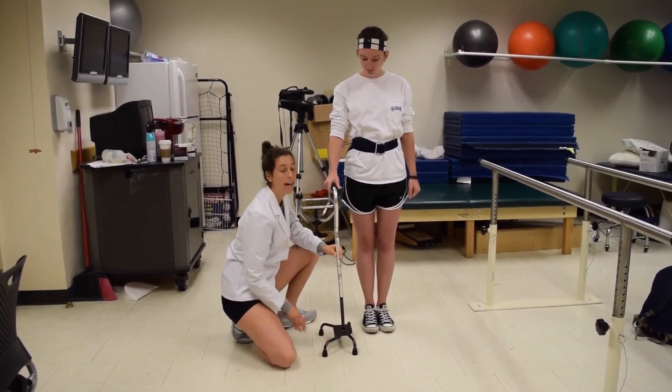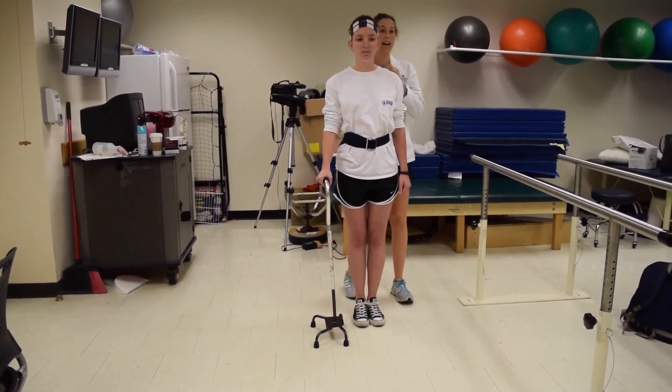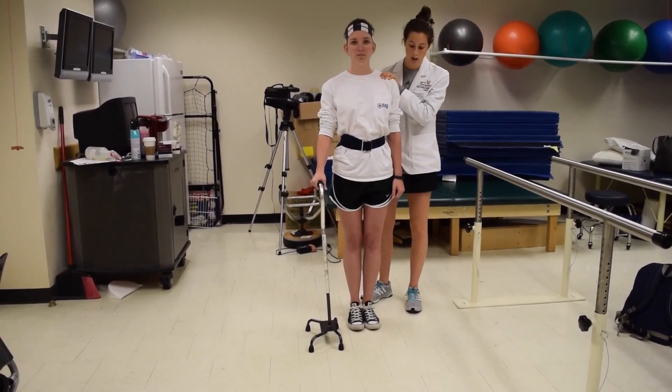Courtney, does that feel comfortable? I'm just going to move it a little bit back for that elbow flexion we're looking for. Before we get started, I'm coming behind my patient under that gait belt and to the side of her with my hand on her shoulder for extra support. Courtney, do you feel stable?